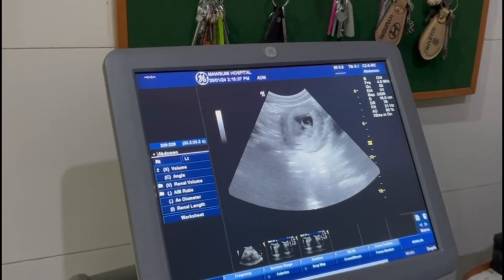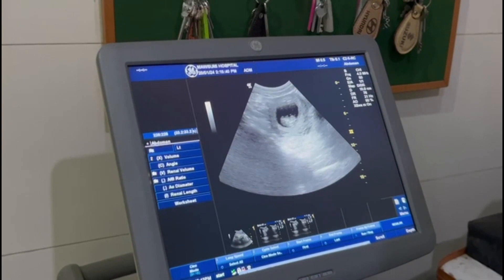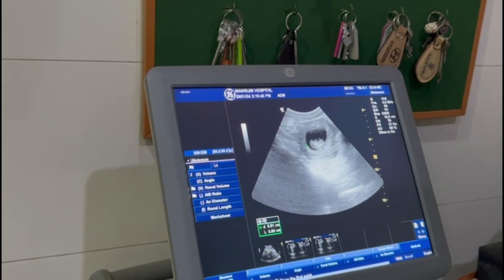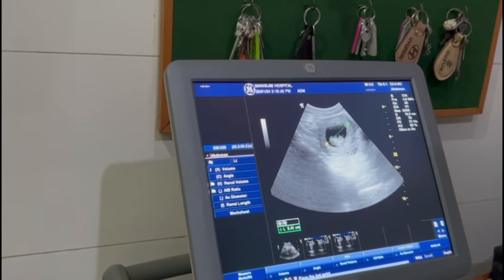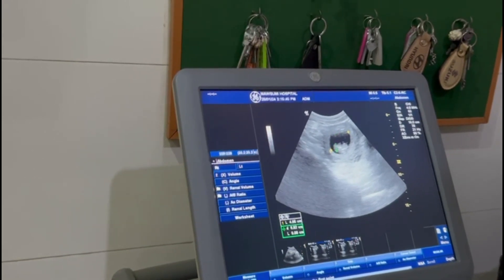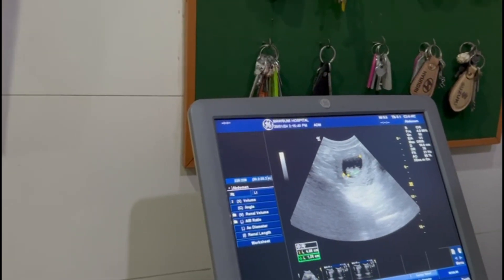It is the baby. I am measuring the sac length from here to the longest possible, longest side. This is the sac, and the crown rump length is from here to here.